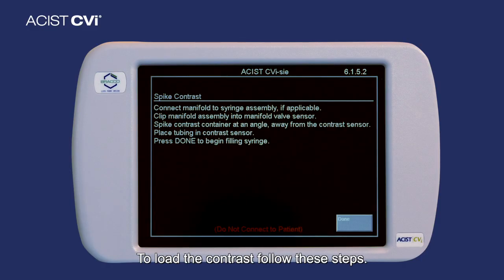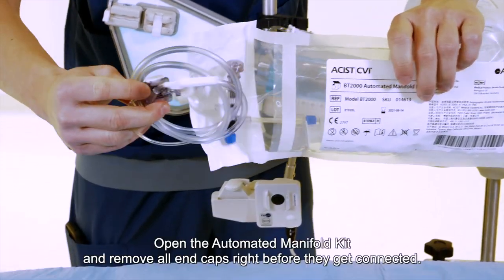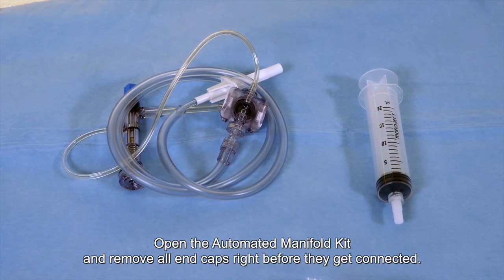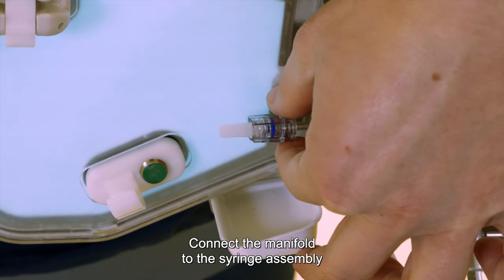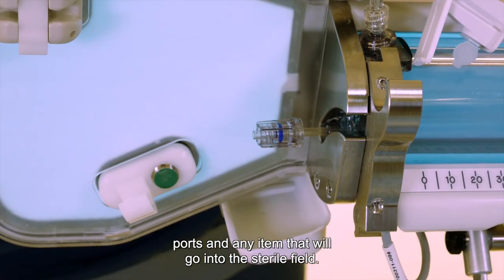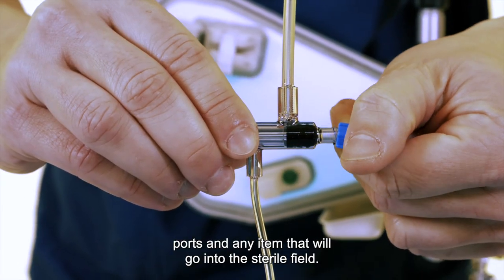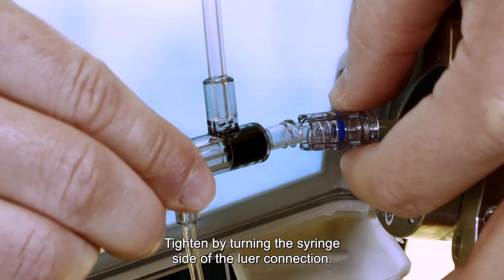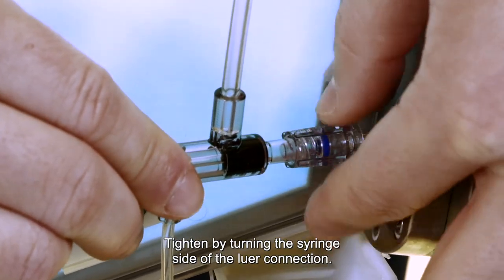To load the contrast, follow these steps. Step 1. Open the automated manifold kit and remove all end caps right before they get connected. Connect the manifold to the syringe assembly, taking care to use aseptic technique on all fluid ports and any item that will go into the sterile field. Tighten by turning the syringe side of the luer connection.